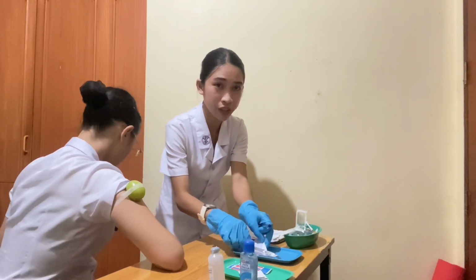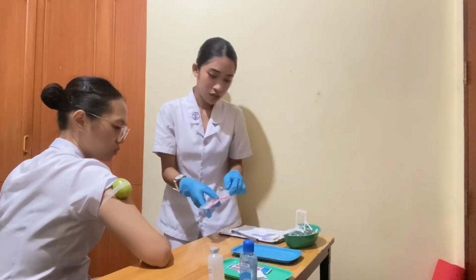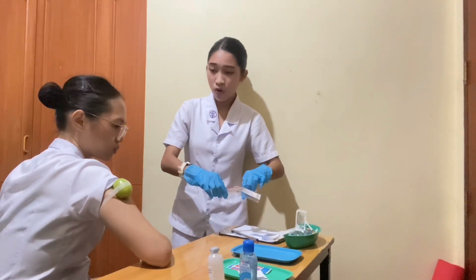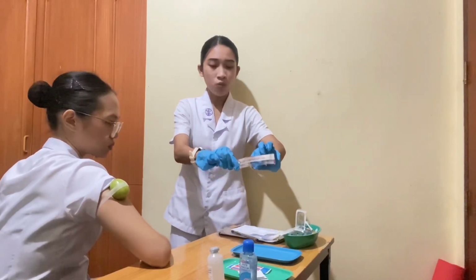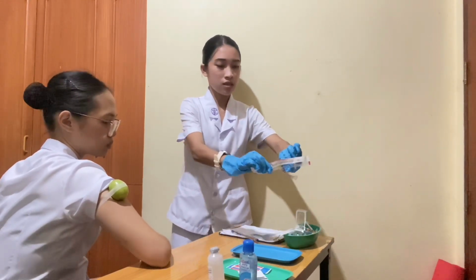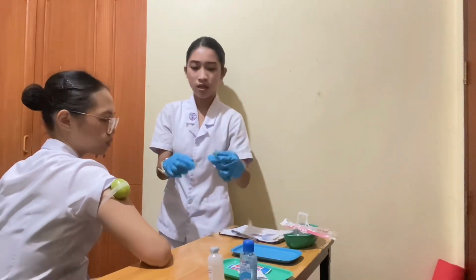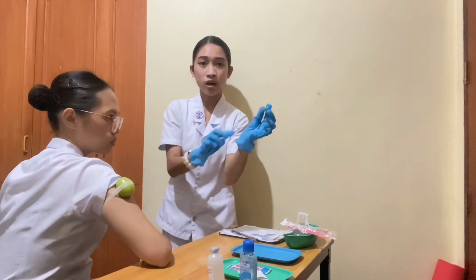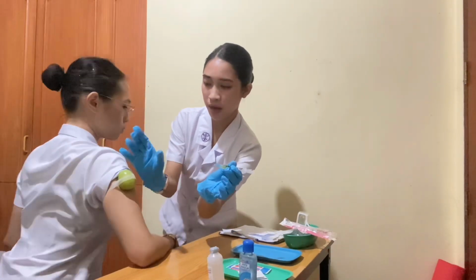Ma'am, mag-inject na ko sa imong ano, ma'am, ha? Intramuscular, ma'am, sa imong deltoid. By opening this one. Dispose. And then do a Z-track method.